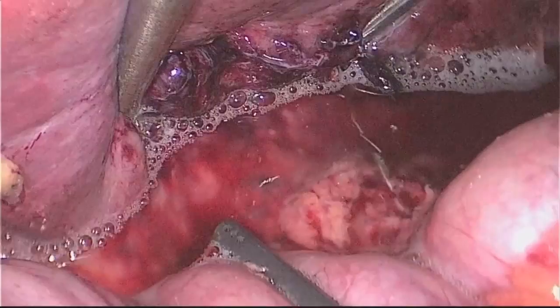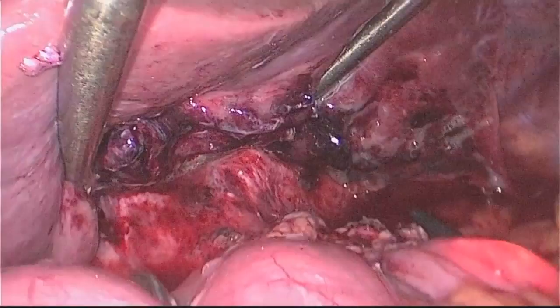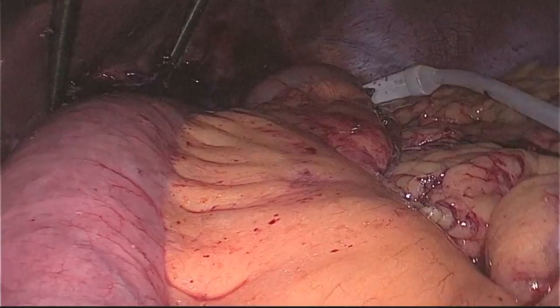An endoscopic leak test was performed at the end of the case, with the endoscope easily passing into the Roux limb without any evidence of a leak. The anatomic orientation of the Roux limb was assured, and a JP drain was placed at the end of the case.